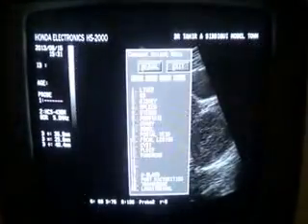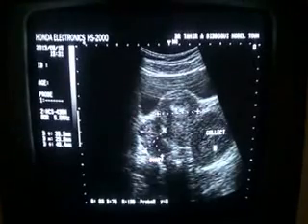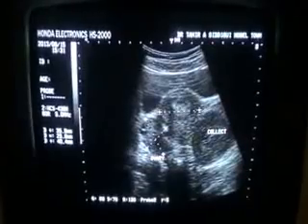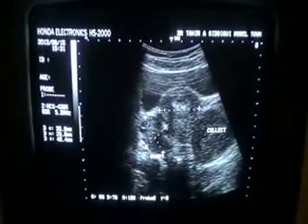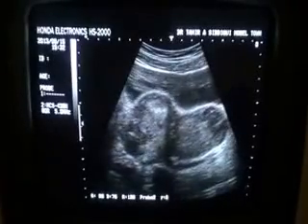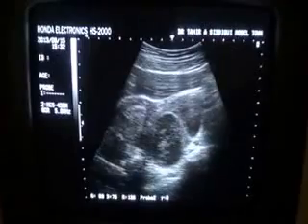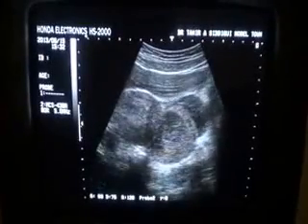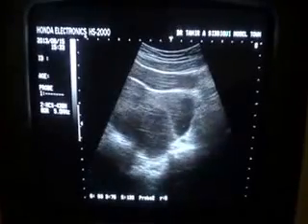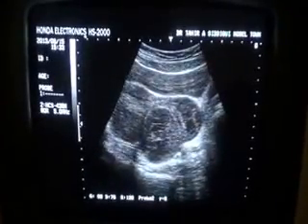Whereas this is the cystic area full of internal echoes, which is on the left side. Now on the left side you can see there is a multiloculated thick-walled collection of fluid with internal echoes, with thin septae.